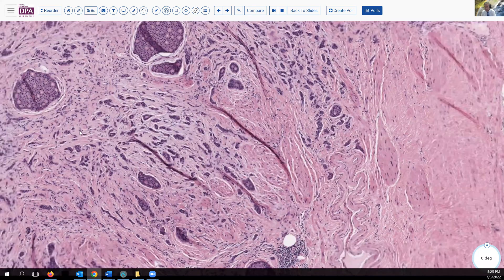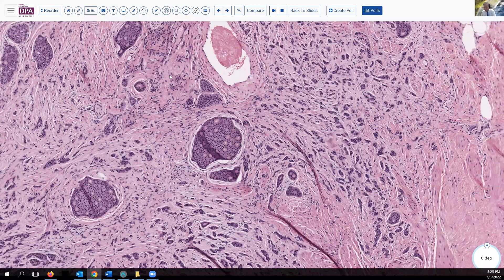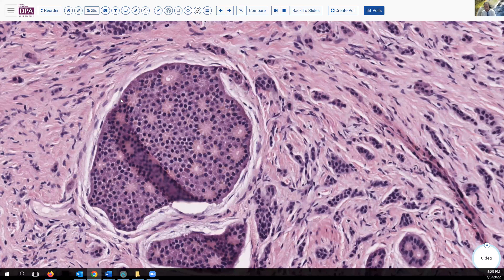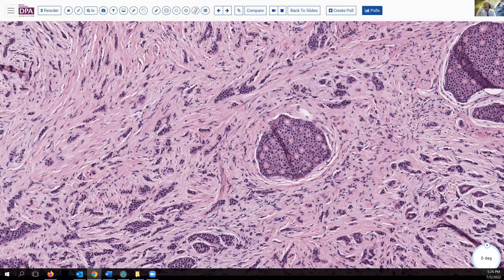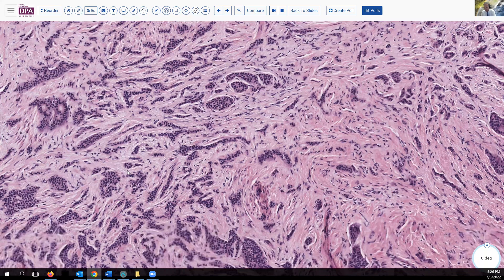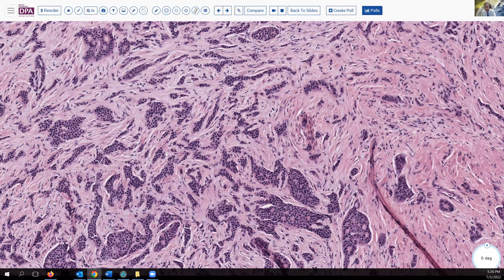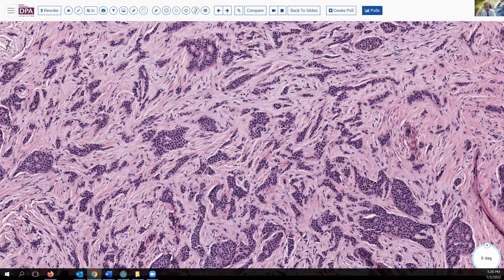Recognizing this pitfall — what might have helped? Recognizing the very sharp borders of these nests, where we have this rosette-like formation of pseudoglandular forms, can help. Because usually neural glial rosette forms have a very gradual fading out of the small blue cells, not this sharp insular pattern. The second feature is this insular pattern, which would be extraordinarily uncommon in a neuroglial lesion — with this fibrosis and these trailing cords and nests of cells in between the tumor. Neuroglial tumors can have a fibrotic background, but not quite this fibrous pattern with infiltrative cells in between and quite distinct sharp margins.